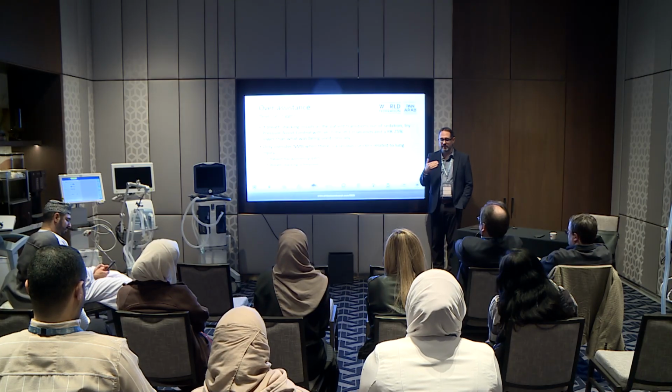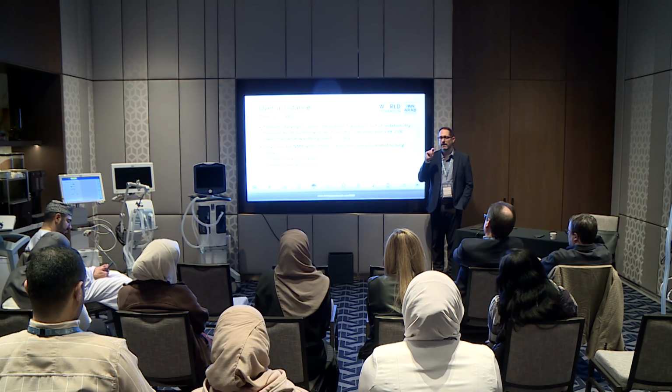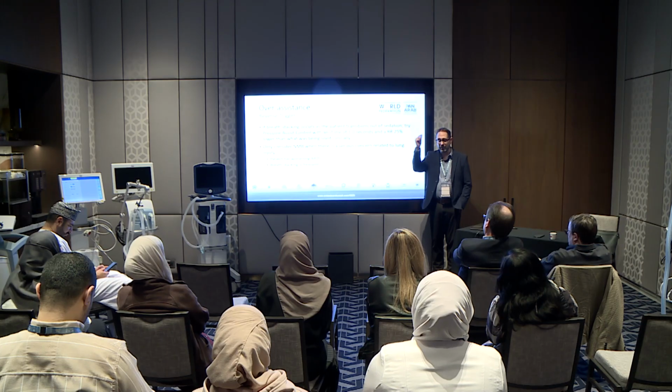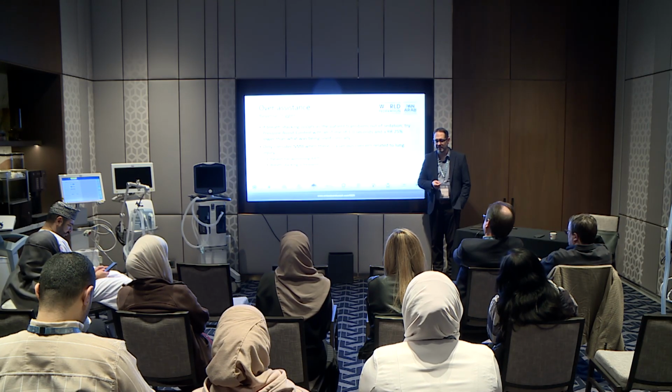The problem is we did a study on this, myself and Felipe Damiani, we published this paper looking at reverse triggering in the first few days of mechanical ventilation. And what we found is patients with a higher occurrence of reverse triggering are actually more likely to be switched to pressure support or extubated the next day.